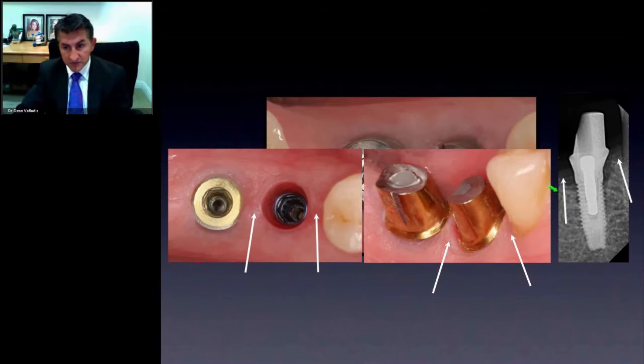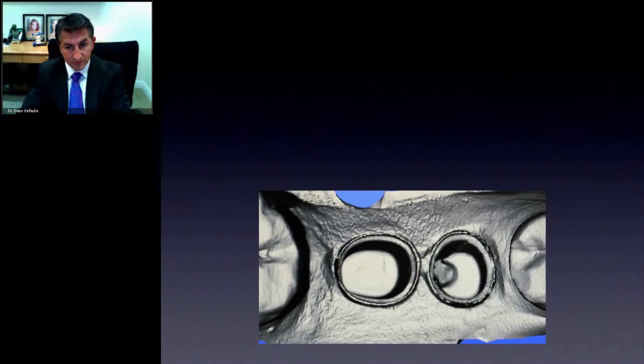We see here that the most important thing is to show them where the bone level is. We can see here that this bone level cannot be extended. That margin that you see here cannot go further out because there's bone there. If the technician does not have that x-ray, they're not going to really know how far they can extend that abutment. So by having the biotype and the bone levels, they can better predict that emergence profile from each digital abutment. And that's going to save the doctor and the patient a lot of time, because they have to sit there and play with it and change it because it's hitting the bone. So that's a critical factor of the tissue and the bone.